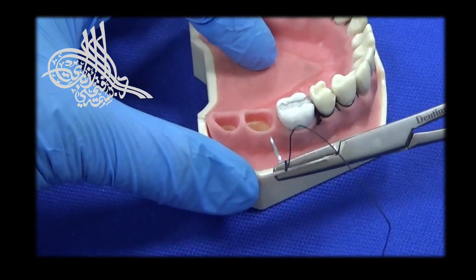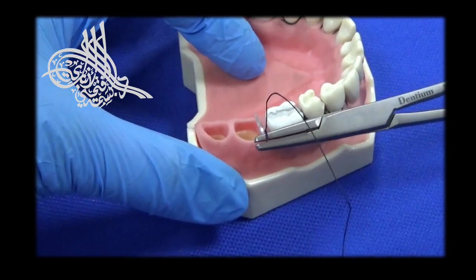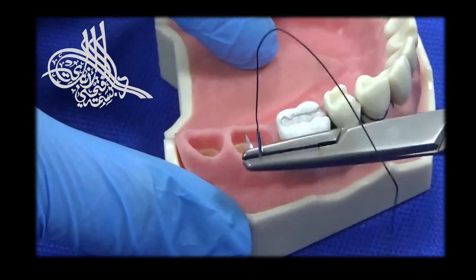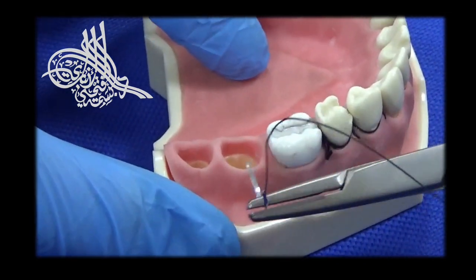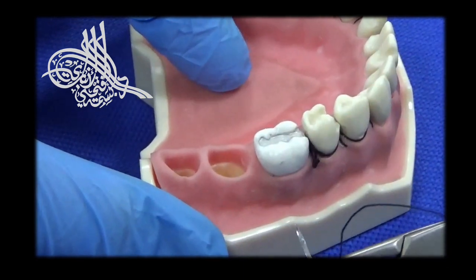Next is the figure-8 suture, a very useful type of suture in closing extraction sockets or in cases of socket preservation procedures where we apply artificial bone and collagen membrane to preserve the bone in the area for subsequent implant placements.